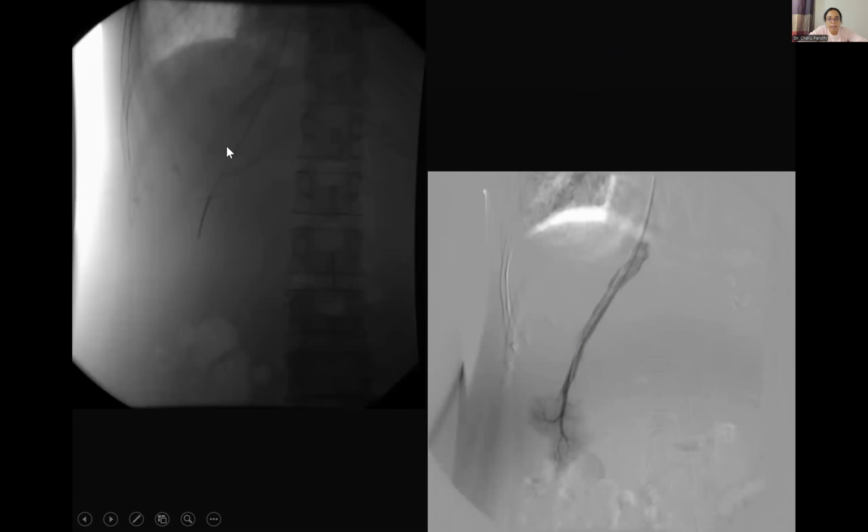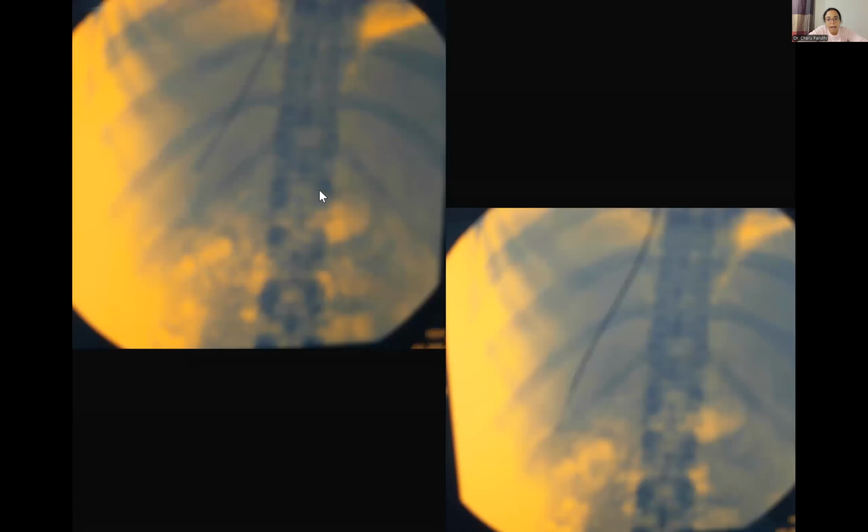So these are the steps wherein first with the catheter, we are inside the right hepatic vein, a check angiogram is taken to confirm the position. And then the sheath is taken over the wire, and then through this, the biopsy is taken.